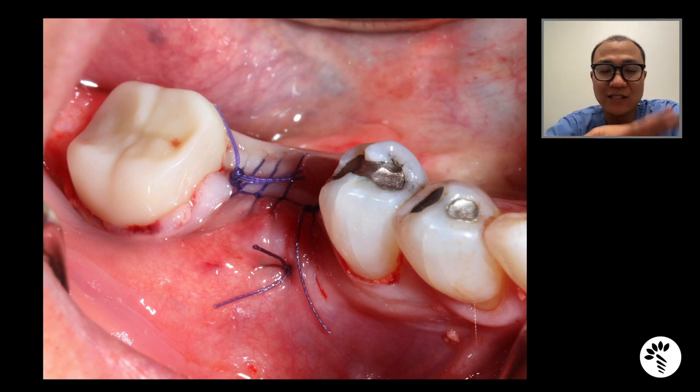The site can now heal without any disturbance or worry about the flap opening. And even if it does open from tension, it will take much less time to close compared to when you leave the membrane exposed from the beginning on purpose. I don't always do it this way, but in certain cases where getting primary closure is more important — especially when buccal bone is missing or there's a large infection — I like to close the socket like that.